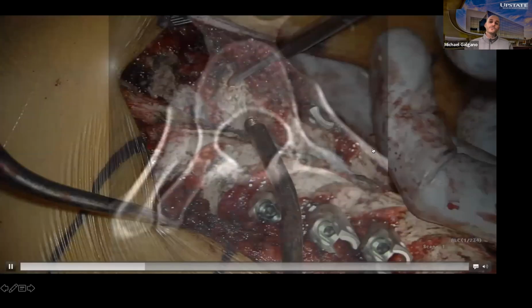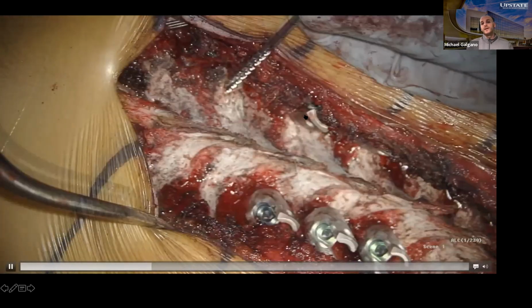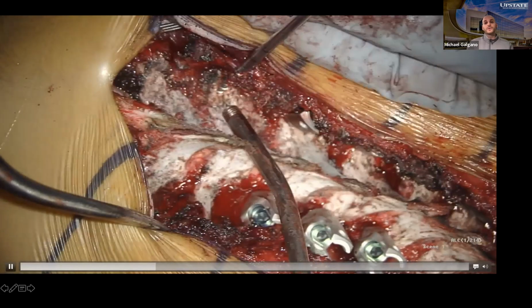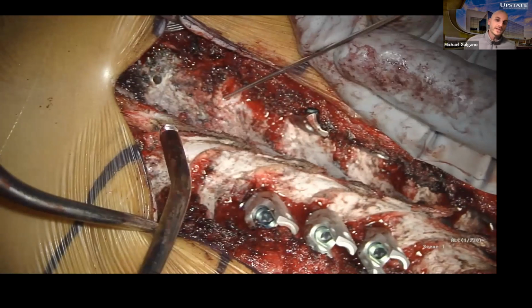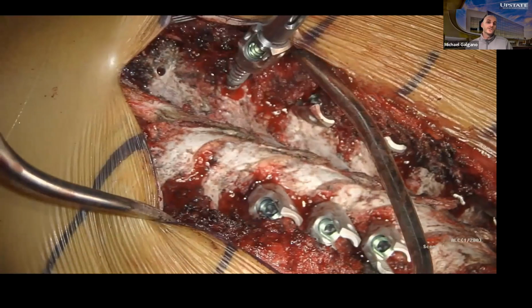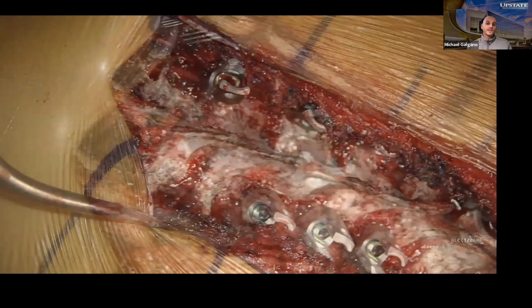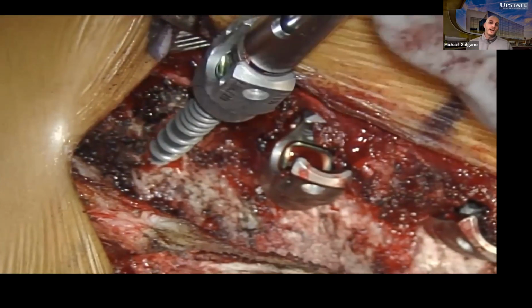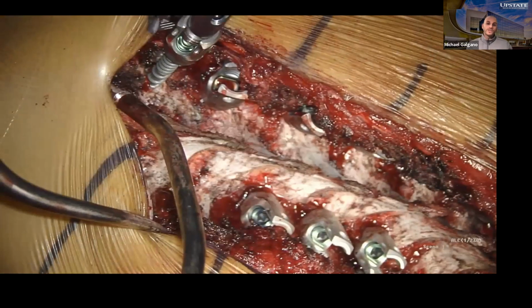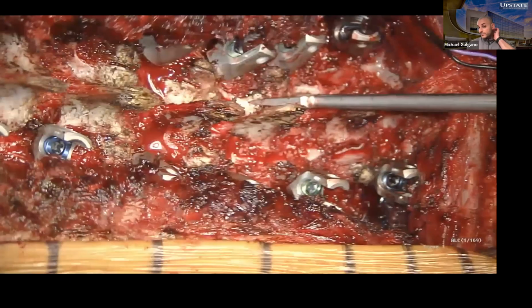Now, these are some very hard pedicles to place, right? These concave hypoplastic pedicles. These are the ones that maybe you could dilate up a little bit. These are also the ones that I typically use a K-wire for, because if you are freehanding them, on occasion you'll get a lateral breach. Like I think I did it at a handful of these, and this is where the K-wire comes in handy to make sure that you've got a nice bony bridge between your breach and your good pilot hole there.